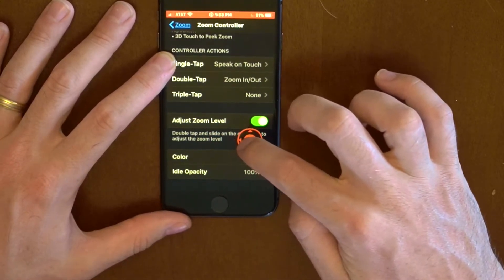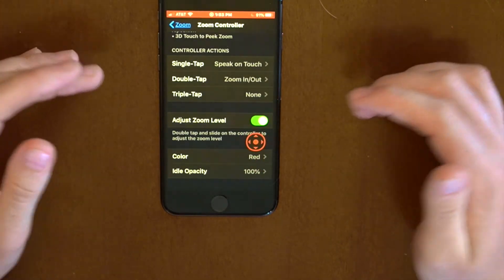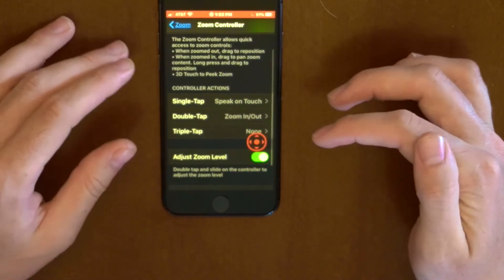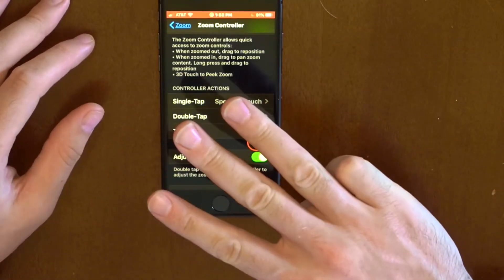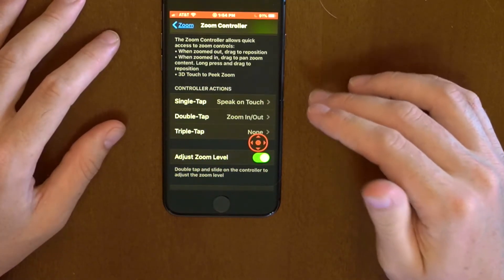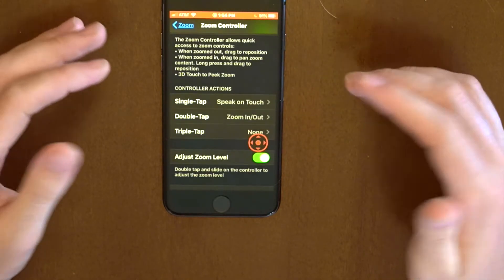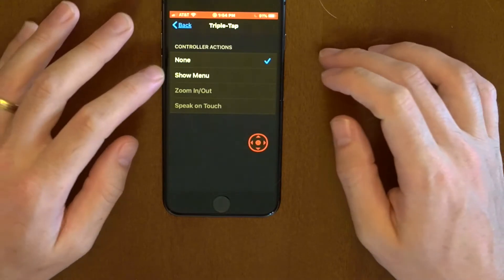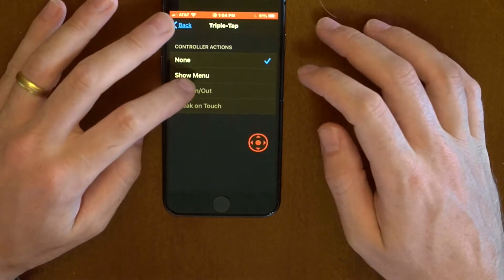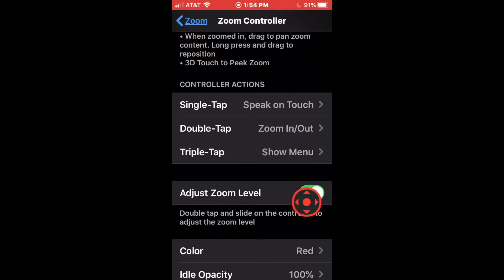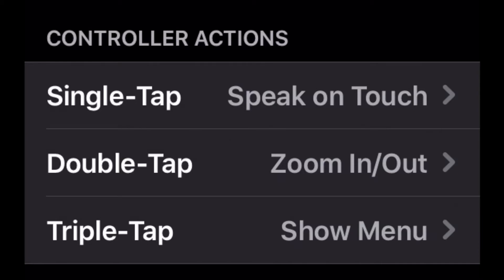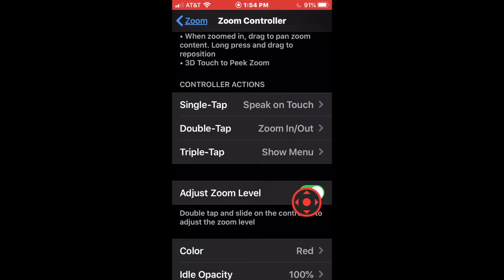Now, what we can do with this controller is a few different things. We can use it to zoom in and zoom out rather than using that three-finger gesture. We can also use it to have text read aloud to us, and we can also use it to invert colors and things like that. Inside this menu, we have options to dictate how it works: we can say what a single tap should do, what a double tap should do, what a triple tap should do. So we can kind of set it up how we like it. At the moment, I've got it set to single tap: speak on touch; double tap: zoom in and out.